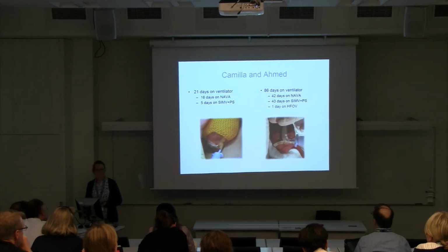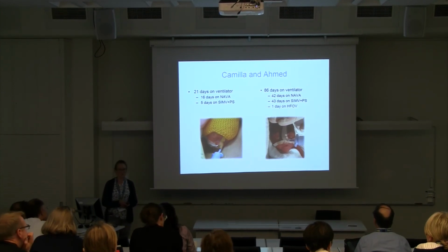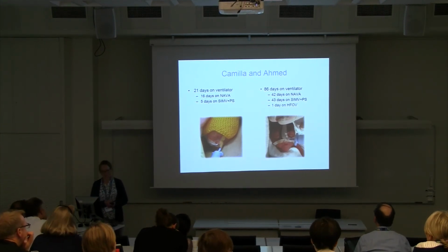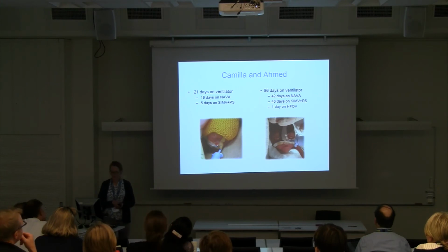So to go to these patients again, Camilla, the 24-weeker, was 3 weeks on the ventilator, of which 16 days on NAVA. She was 5 days on conventional settings because she needed her ductus to be ligated.